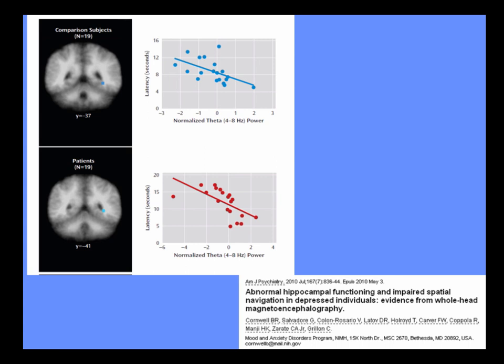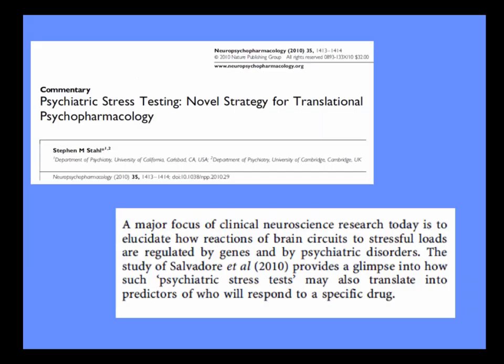There's two things good about this. One is that we've got this behavioral correlation. The other is that it reifies our ability to see a signal from a deeper structure, namely the hippocampus. And then, the primary interest was that this is different in depressed individuals. So we can see differences across neuropsychiatric groups at other than just the cortical surface. We can see differences in the amygdala and in the hippocampus.